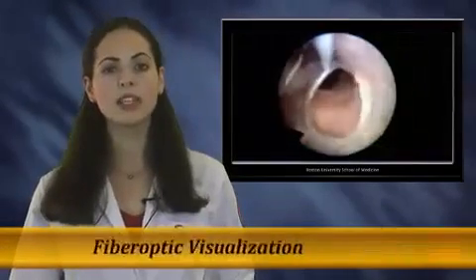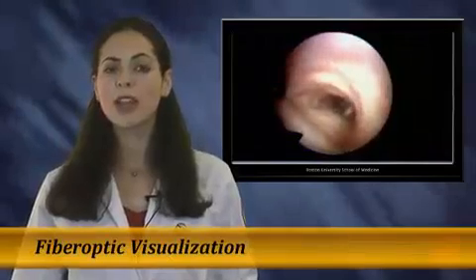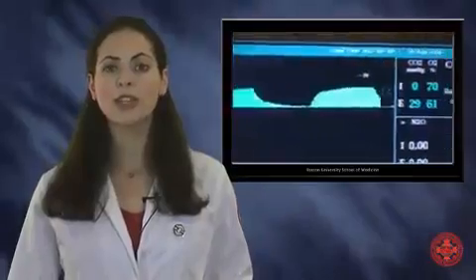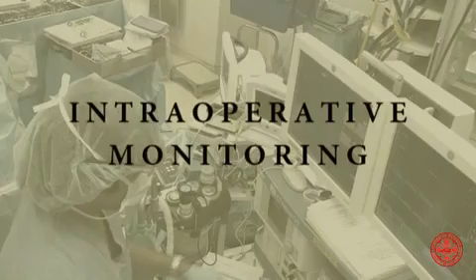Even in the case of visualization of the tube within the trachea using a fiber optic instrument, it is possible for the tube to migrate above the glottis or beyond the carina. Therefore, it is imperative to continuously ascertain the correct position of the endotracheal tube throughout the anesthetic.